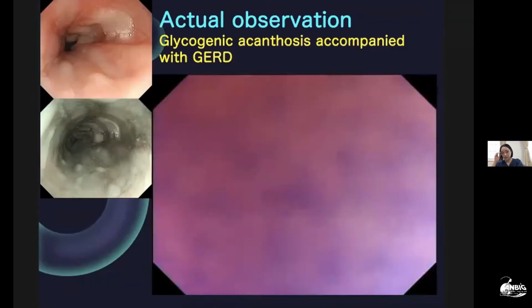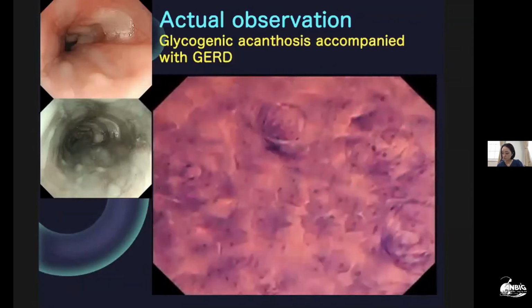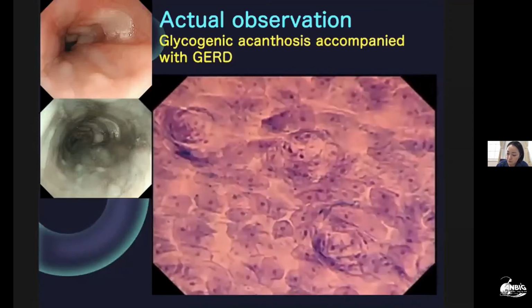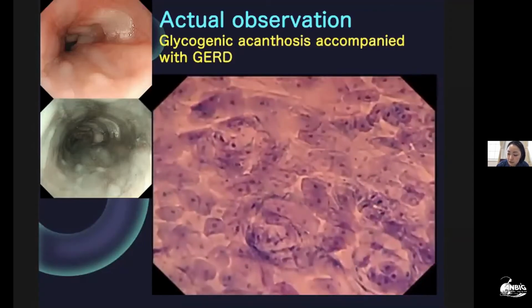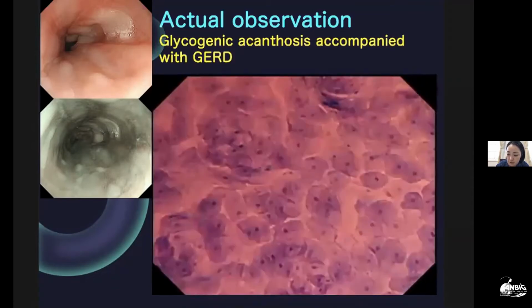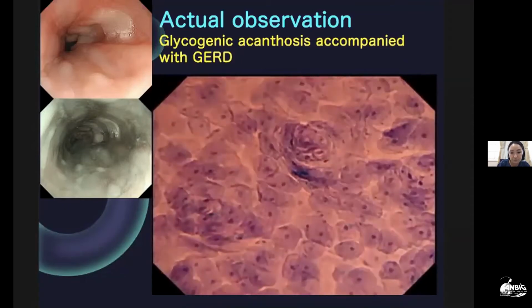This is the actual observation. Before endoscopy examination, we wash the mucosal surface with clear water to remove mucus and bubbles. It is quite important, especially in the stomach. Then we approach closer to the target slowly and gently, and then up the zoom, just like this.